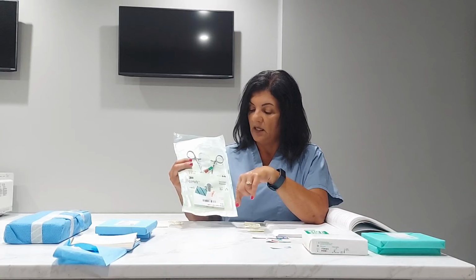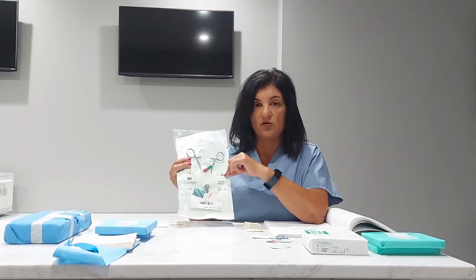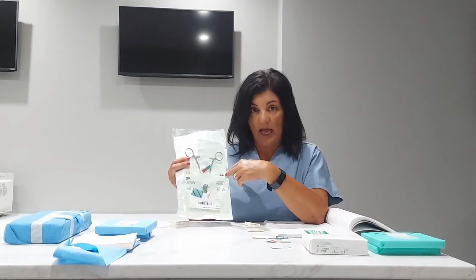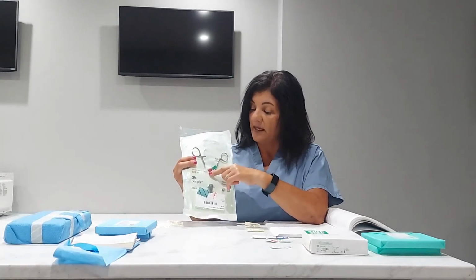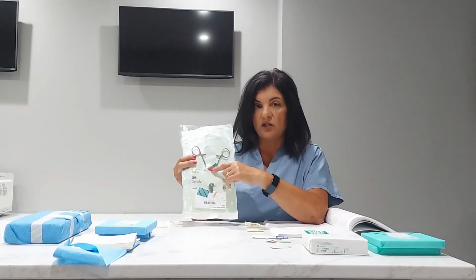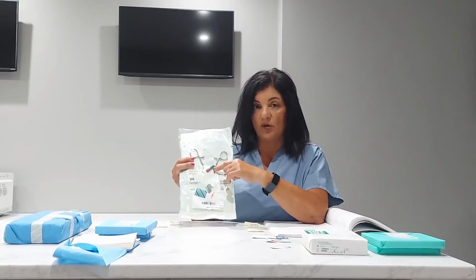My second indicator that this has been sterilized is that these diamonds on this internal card, which is another visual for me, have changed to black. And my third indicator is that my class 5 indicator right here has changed from white to black into the window where it says it is acceptable.